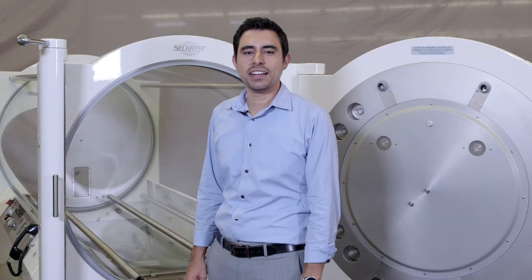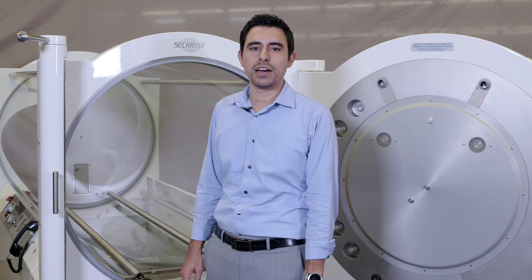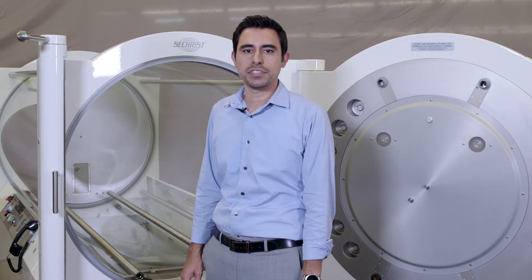Hi, I'm Fernando Sandejas. I'm a mechanical engineer with Sechrist Industries, and today we're going to show how to install a Sechrist Free-Flow Airbrake Assembly on a Sechrist chamber.